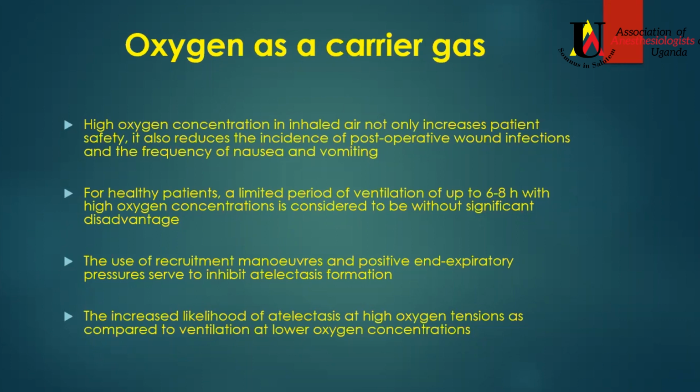The use of recruitment maneuvers and positive end expiratory pressure serves to inhibit atelectasis formation. We shall see this a bit later on. There is also an increased likelihood of atelectasis at high oxygen concentration as compared to ventilation at lower oxygen concentration.